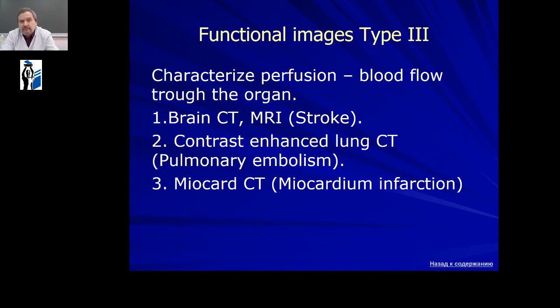Next type of functional images, type 3, characterize perfusion. What does perfusion mean? It is blood flow through the organ. Examination of brain, for example, brain CT, computer tomography, or brain MRI, when we diagnose stroke.